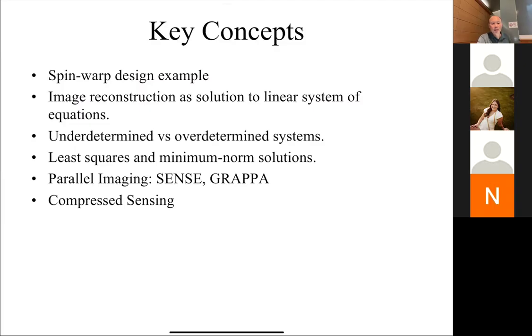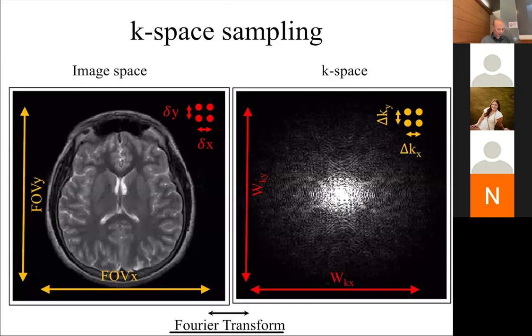Then we're going to switch gears and talk a little bit about how imaging is actually done today, which is more from a linear algebraic point of view. So hopefully today will be the last day of lots of math, and then the following lectures will start switching into more applications of MRI, and you'll see how MRI is used. If you can make it through this lecture, you'll be through most of the hard part of MRI, so just stick with me.